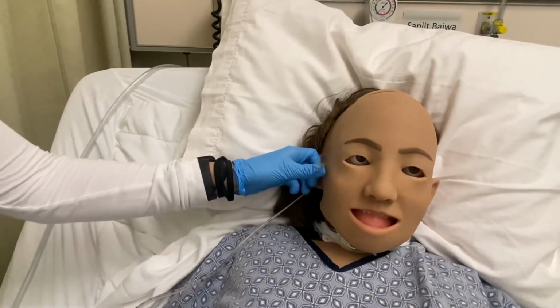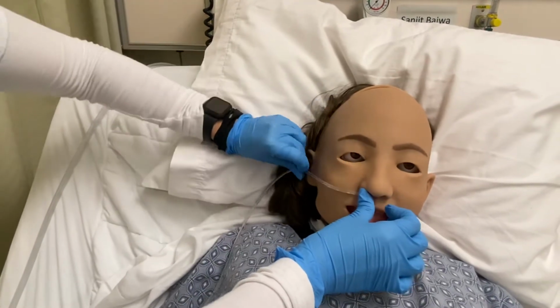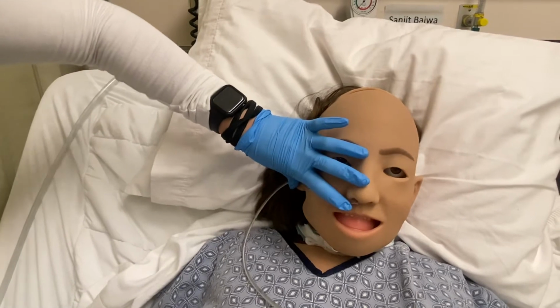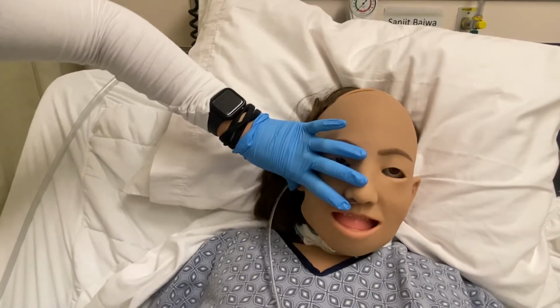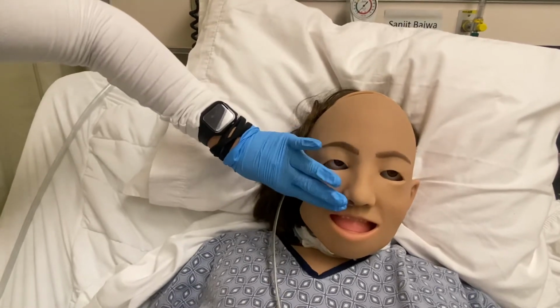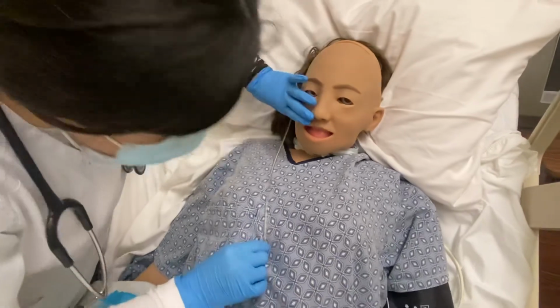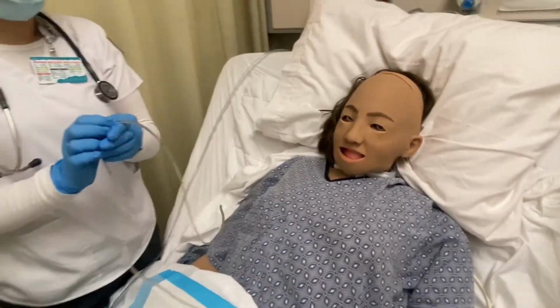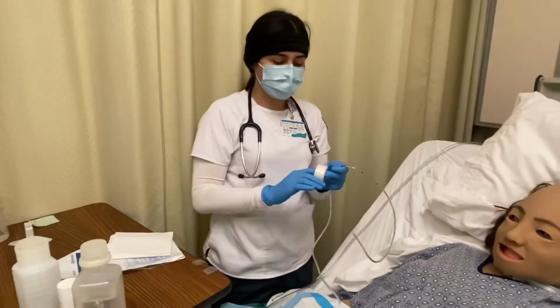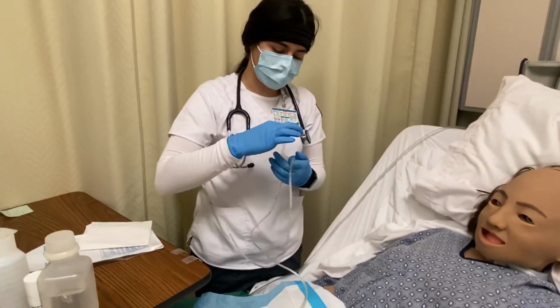So nose straight. I feel it right here. It wouldn't be like this, but so 50. Then I would mark it with tape, or I can mark it with the Sharpie. I'll go ahead and mark it with tape right now.